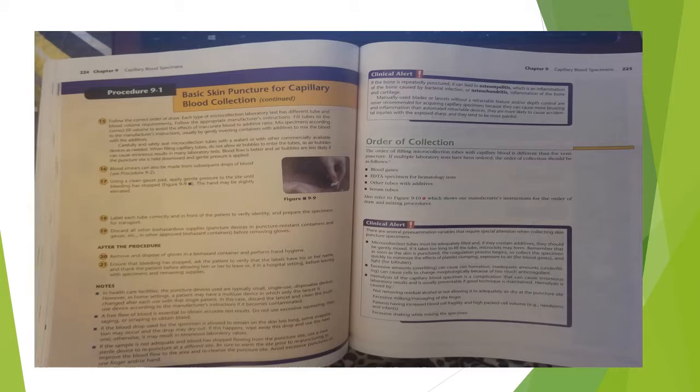Remove and dispose of gloves in a biohazard container and perform hand hygiene. Ensure that the bleeding has stopped. Ask the patient to verify that the labels have his or her name and thank the patient before allowing him or her to leave, or if in a hospital setting, before leaving the specimens and remaining supplies. In healthcare facilities, the puncture devices used are typically small, single-use, disposable devices. However, in home settings, a patient may have a multi-use device in which only the lancet is changed after each use with a single patient. In this case, discard the lancet and clean the multi-use device according to the manufacturer's instruction if it becomes contaminated.